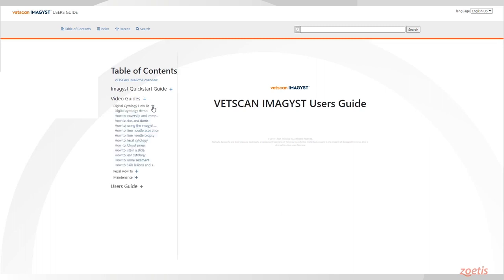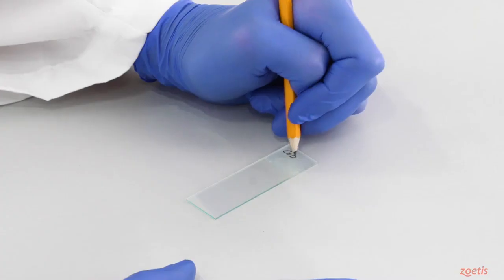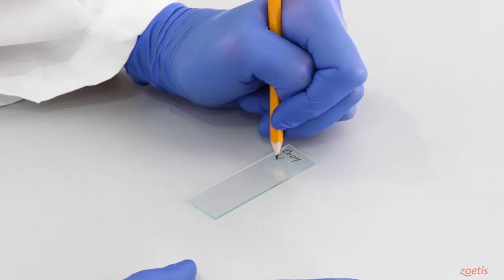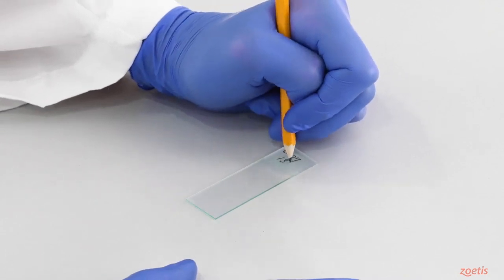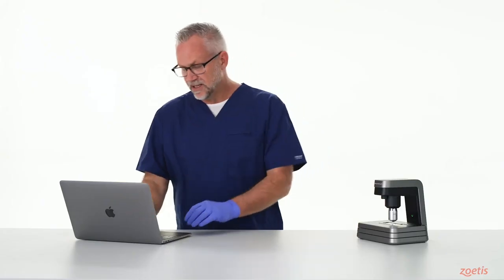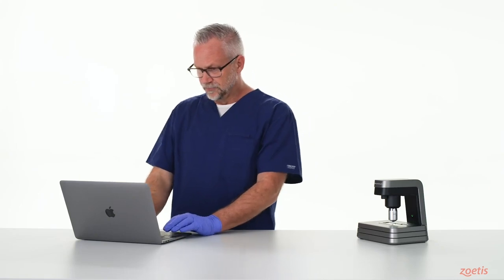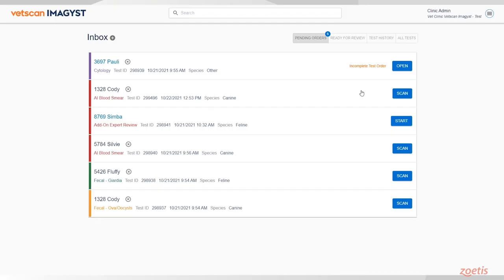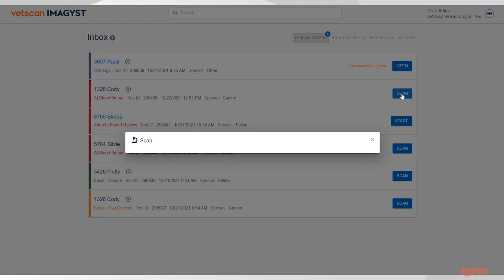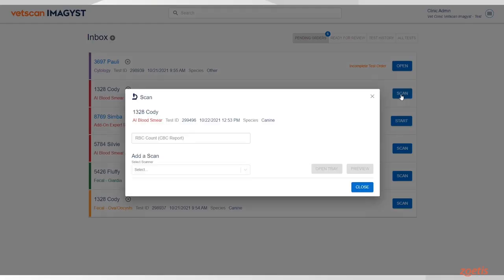Include a meaningful label or handwritten text on the slide. Now log in to VetScan Imagist and select Scan for the correct sample.